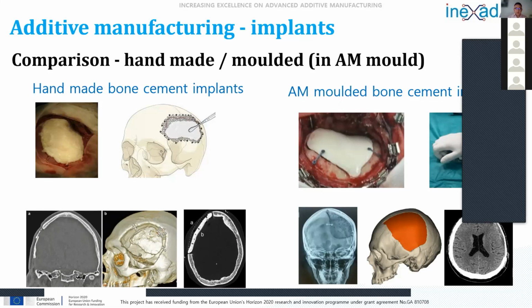So you have PMMA, it's a bone cement, it's a two-component material. When you mix those two components together, you have a few minutes in order to shape the part, and during that time a certain amount of heat is generated, so you hold in your hands quite a hot piece of material which you have to shape according to the patient's needs. And sometimes it's very difficult or even impossible to produce a very precise part which will follow, for example, the curve of the patient's skull.